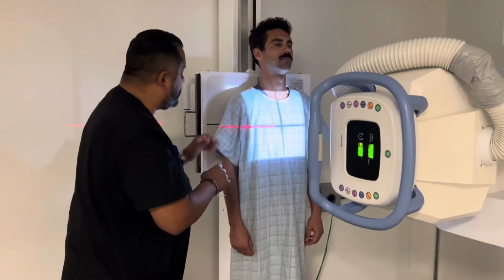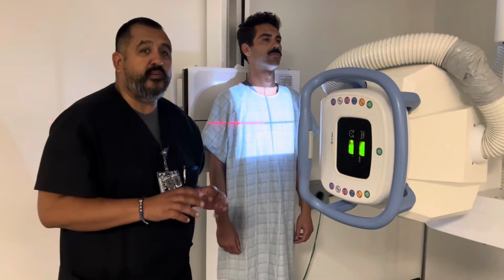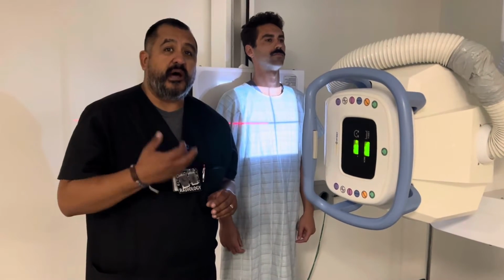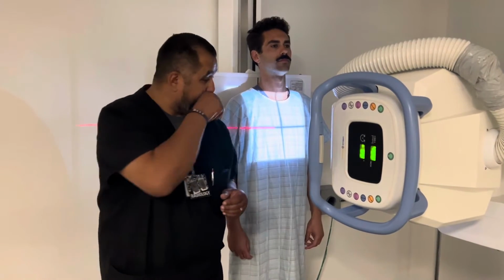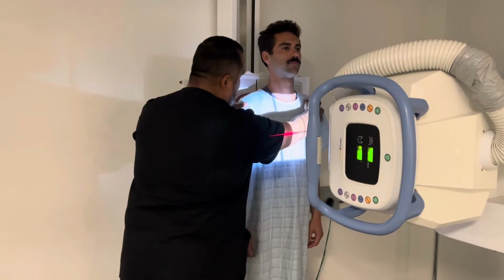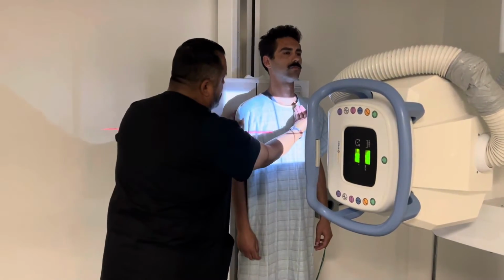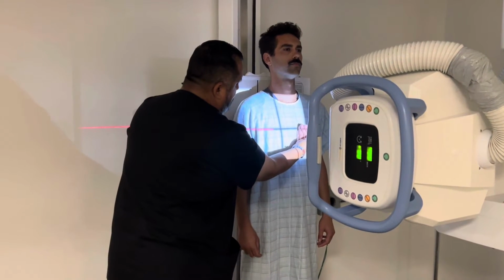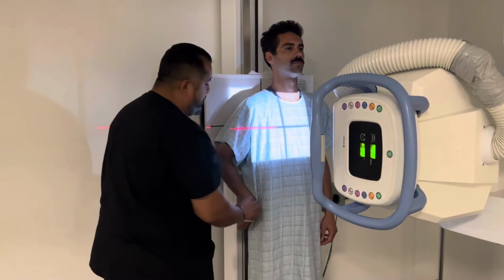We're going to do unilateral ribs. I'll put it in the comments section as well, exactly what you're going to be doing for the area of interest. We're going to have them slide over a little bit. We're doing unilateral, so half of the half. Here's his sternum, here's his rib cage. Now we're just going to abduct this arm a little bit, just out of the way.